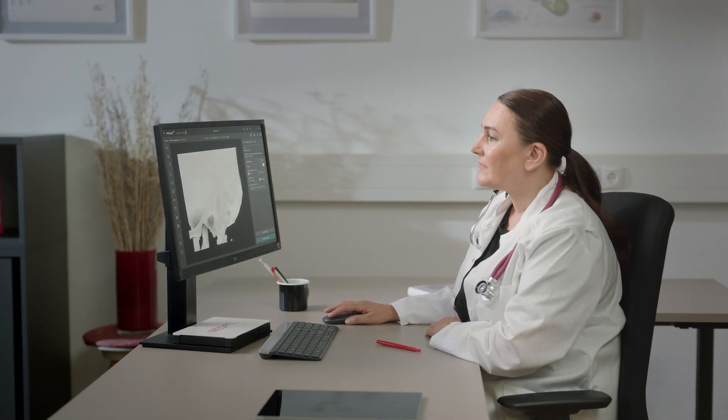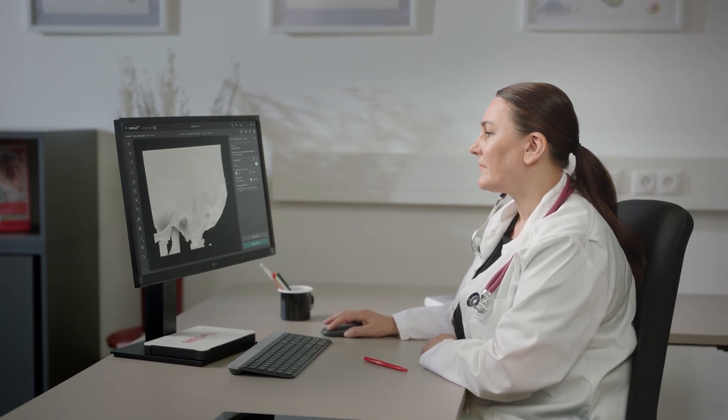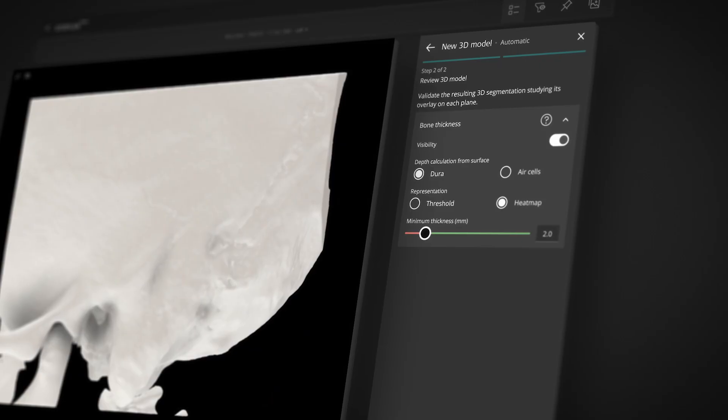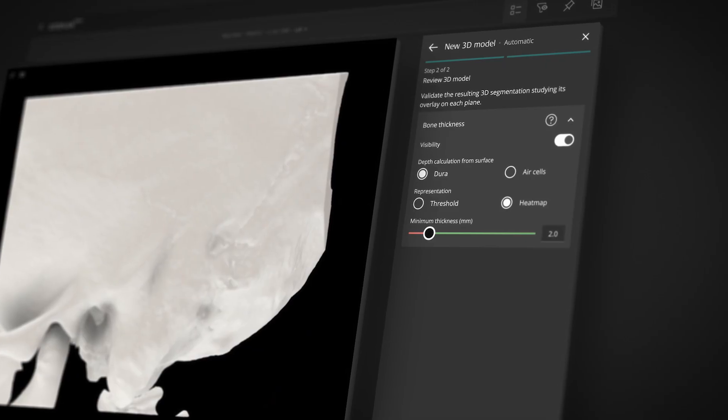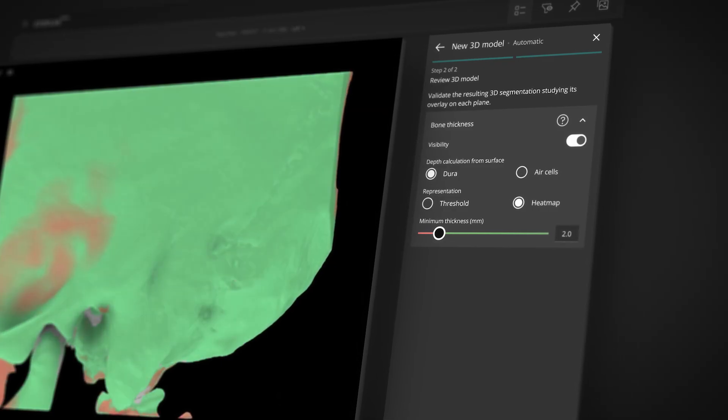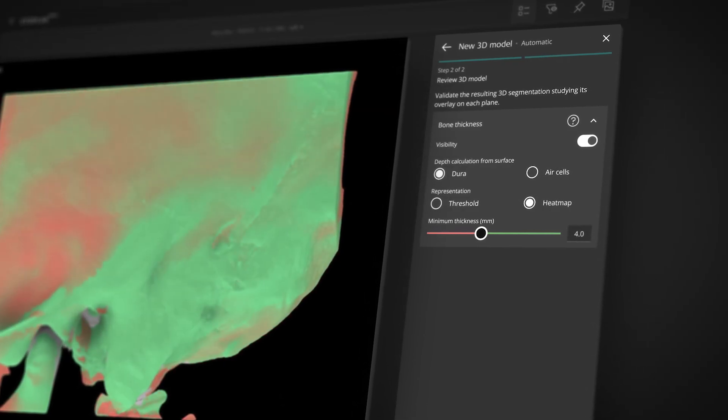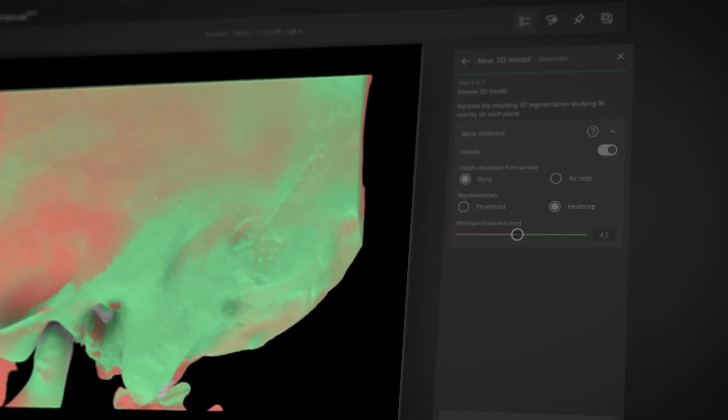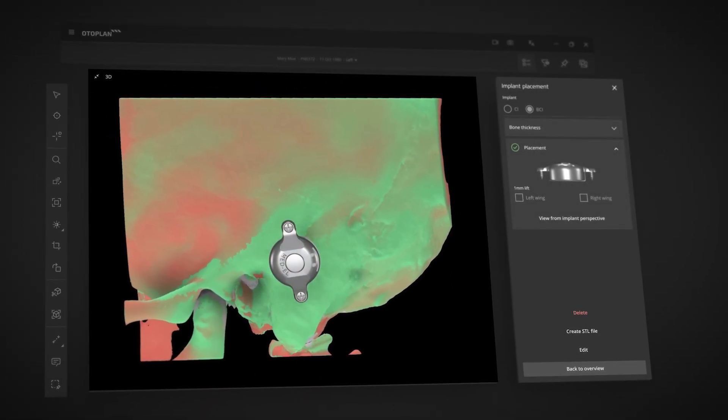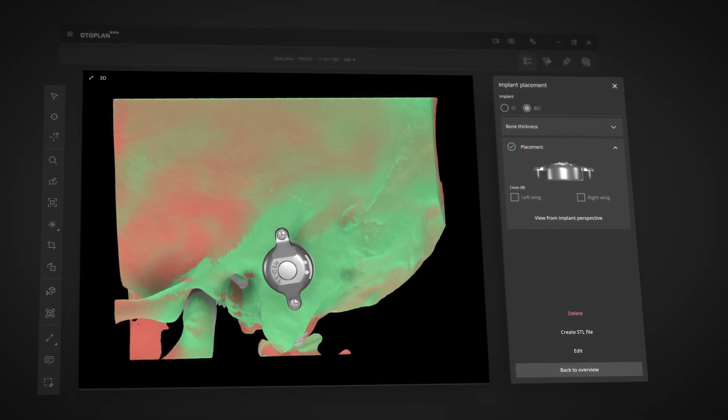And OtoPlan has even more. You can now perform automatic 3D bone reconstruction and thickness mapping. OtoPlan also includes bone bridge placement optimization.